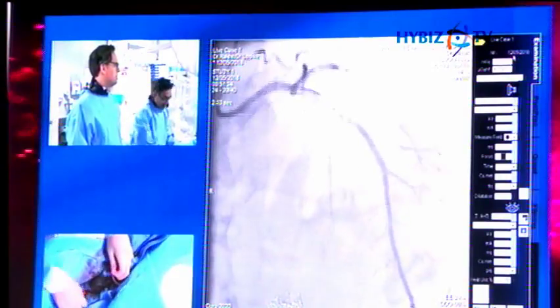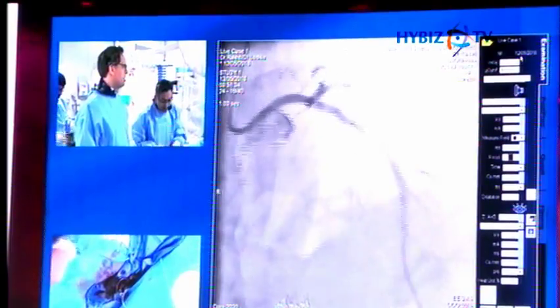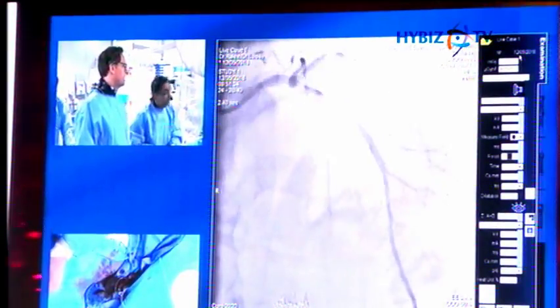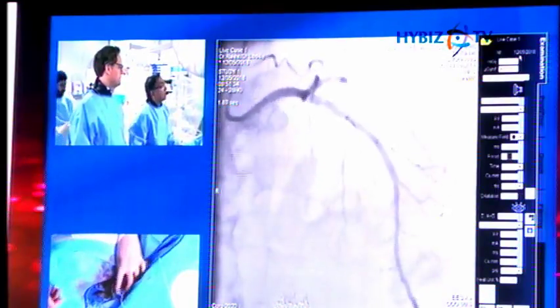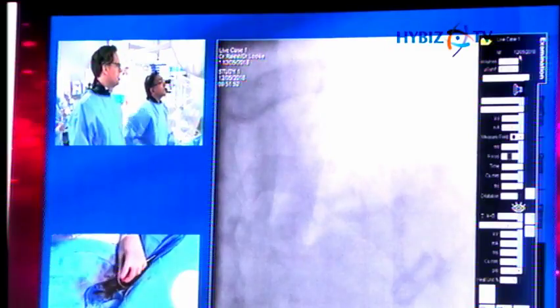So that's after 3.5. We're just now going to take the 5 now. Now, the other thing is, do you think we should take a... I would just watch that distal wire. Take the 5 all the way down. Yeah. Thank you. And how often do you find yourself using this stent?